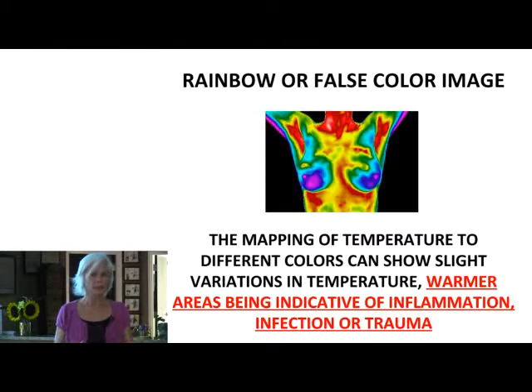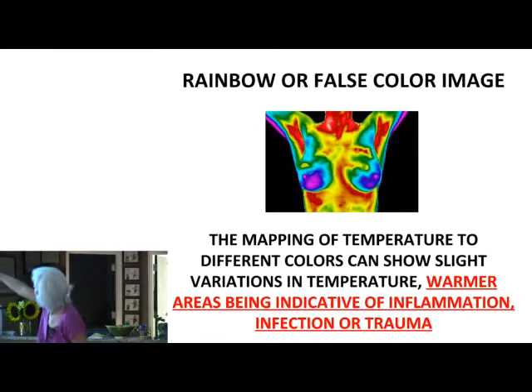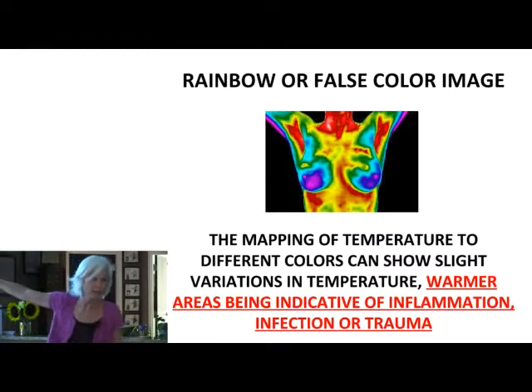Unlike the other screening that's looking for structure, this is looking for heat, and this is showing physiology. I'm going to show you many of these because I have many of these now. I've done about 500 of these.